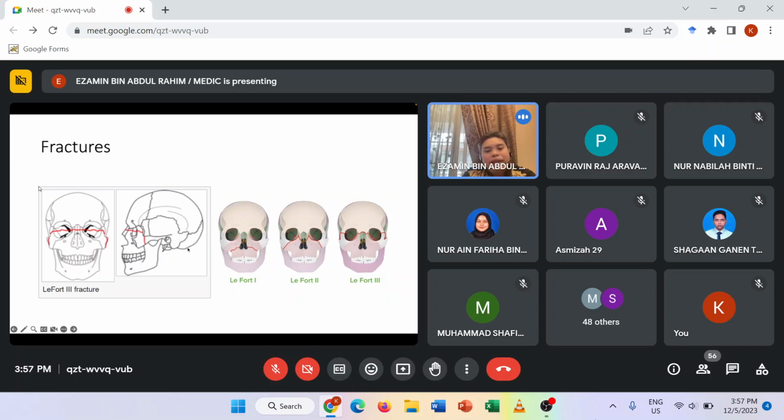And if you see a fracture, you have to see intraparenchymal, whether there is any intracranial bleed. Why I mention this is, Lefort was a French surgeon during the Napoleonic War, if I'm mistaken, you Google it again.